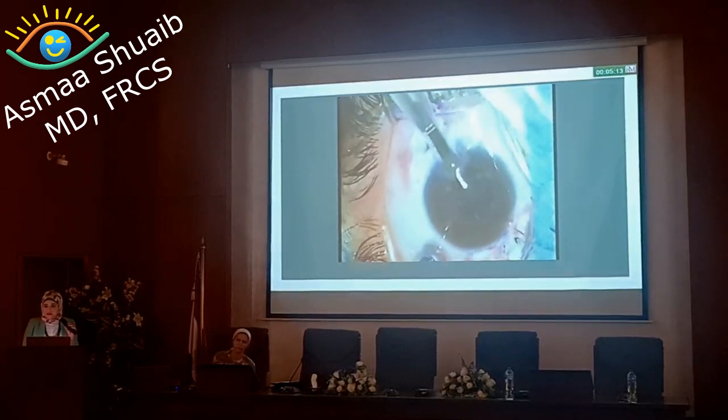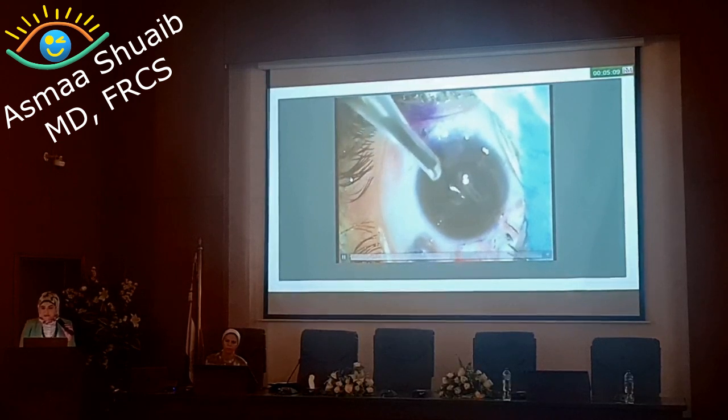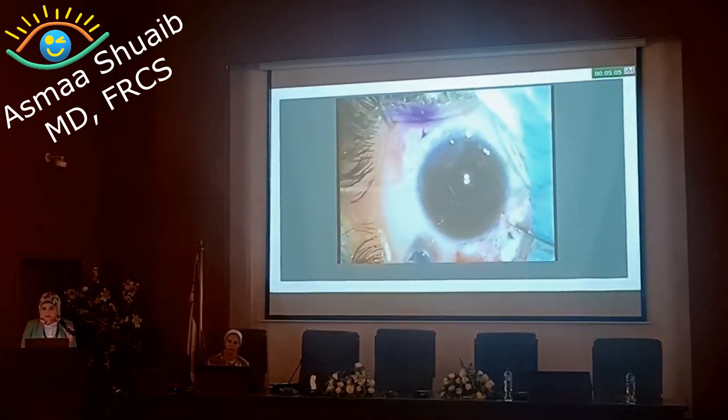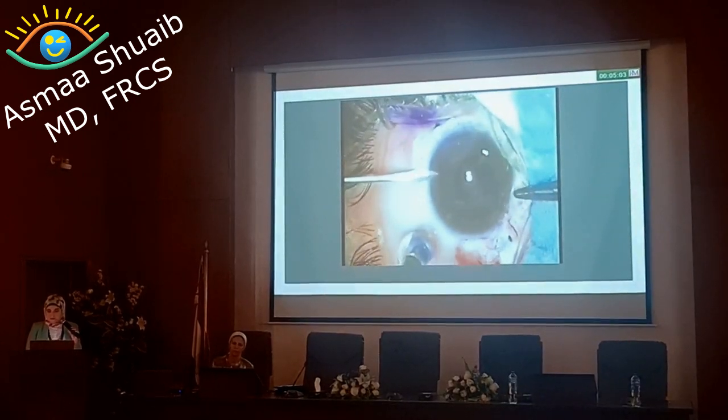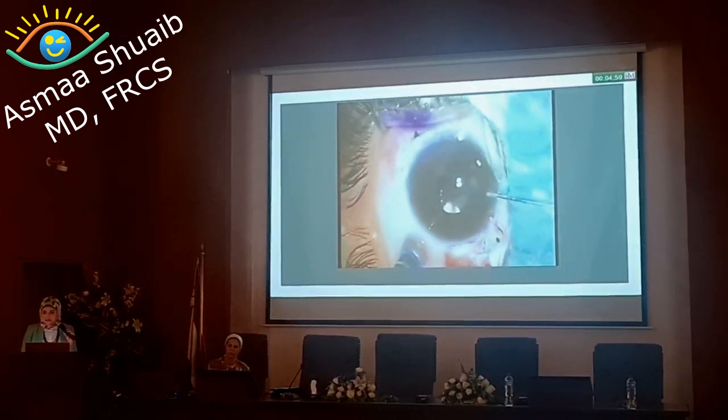This is the leading haptic. And regarding the trailing haptic, it can be managed with the handshake technique.